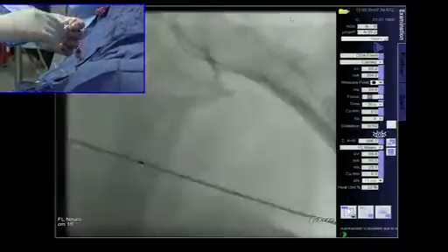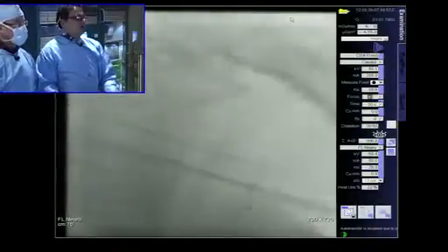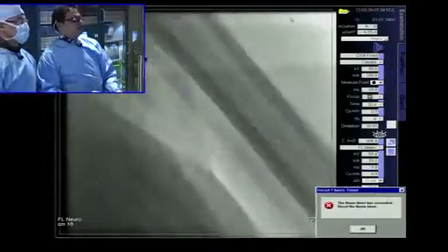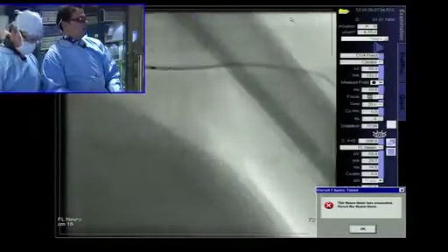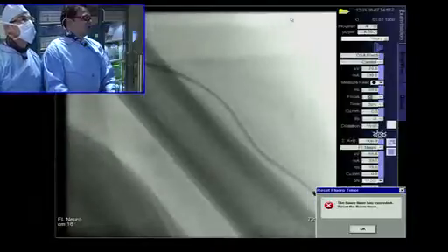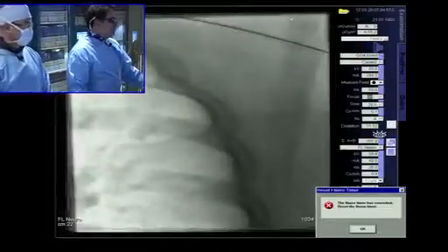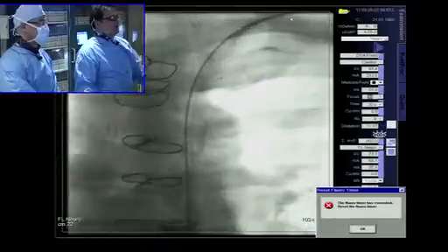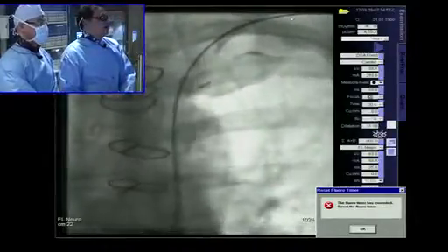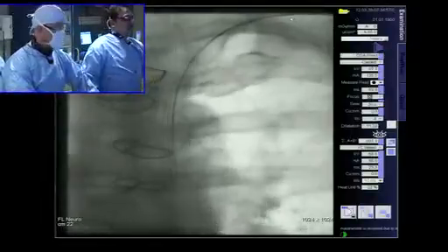It's important again, in certain complex interventions, to go ahead and see where the wire is going into the brachial. You can go lower magnification, Jose, so we can see better. So this is actually quite good. We're way distal now, so I'm pretty happy with where the wire is. Go AP again, Ray. Now we're going to show you where the subclavian is, which is right there. And now you can see we got the stiff part of the wire there. Now I'm going to remove this again, and I'm going to go with the 4 French once again.